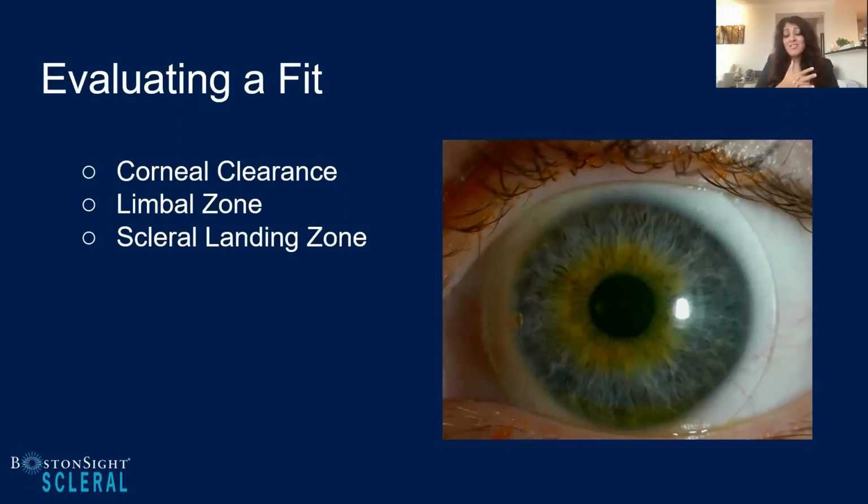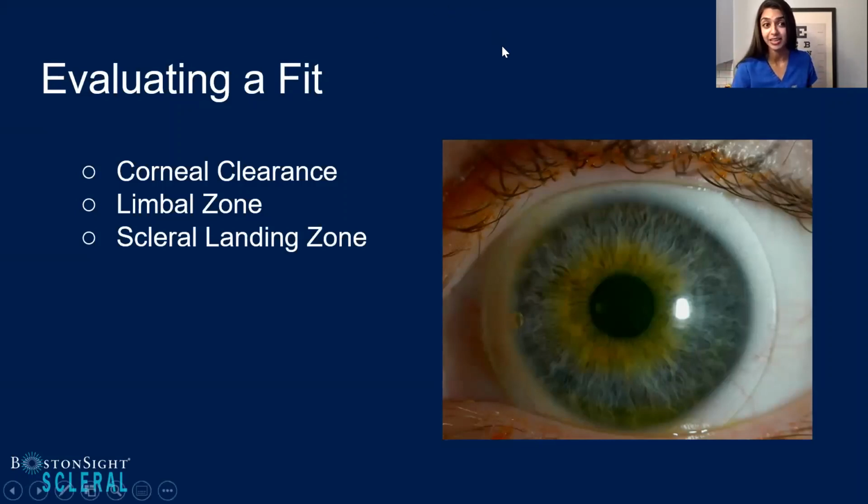And I know, Avani, that if I ask you what your strategy is, I'm not sure if you're doing the opposite. Yeah, so in the world of recent scleral lens fitters, we all know that the first thing we do when we put a scleral lens on is we look to see if the scleral lens is truly vaulting the cornea. And so my strategy always is starting in the middle of the scleral lens and working the way out. So it's interesting that the two philosophies, we do the same thing, but we have different methods to really evaluate different zones. Yeah, absolutely.